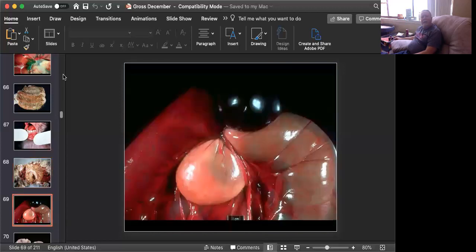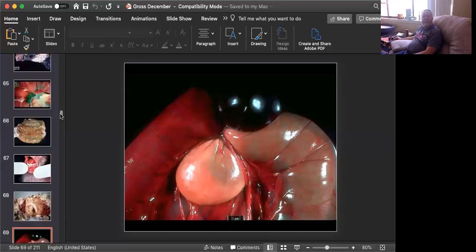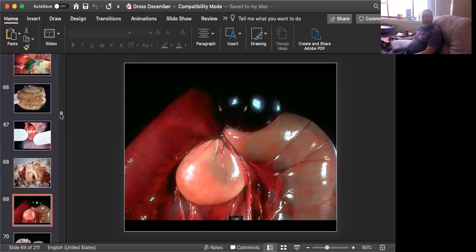Here comes slide number 5. I hope this is a slow pitch for all of you. It's actually slide number 6. But can you give me a morphologic diagnosis? Be specific on this one. This is tissue from a horse. Okay, time's up. This mass here is a mesenteric lipoma.